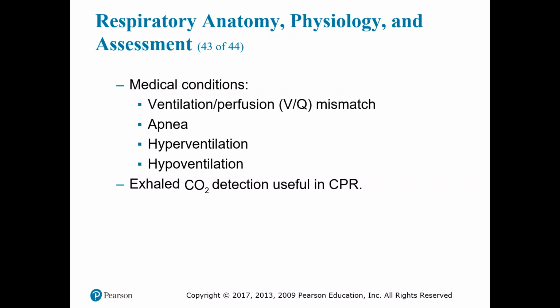Exhaled CO2 is useful in CPR. During cardiac arrest, CO2 levels will fall. Following the onset of cardiac arrest, they begin to rise with the onset of effective CPR and return to near normal levels with the return of spontaneous circulation. So if we're doing CPR on a patient and you're getting an end tidal CO2 reading of, say, 20, that tells you that you are doing CPR.